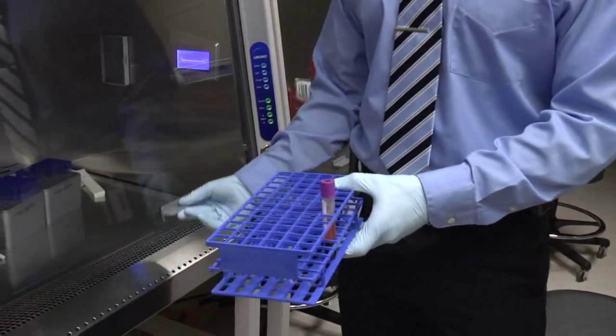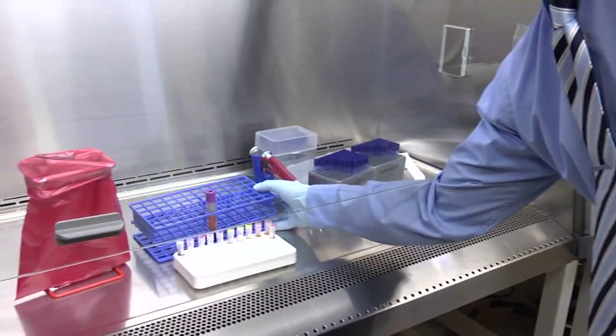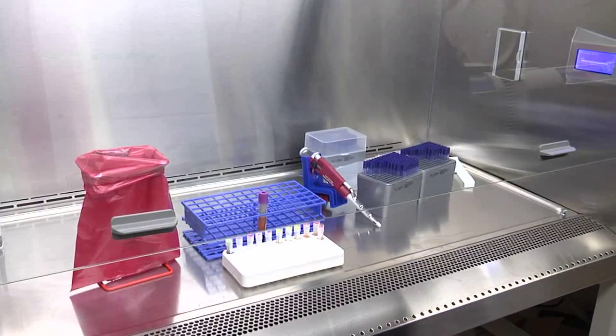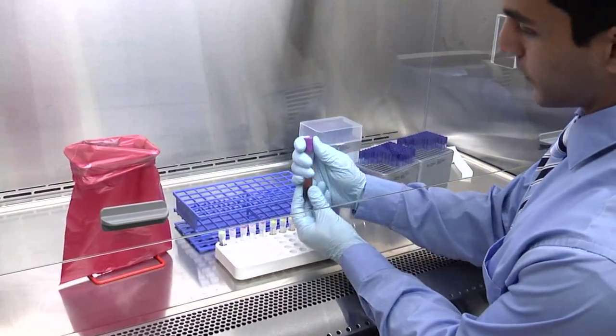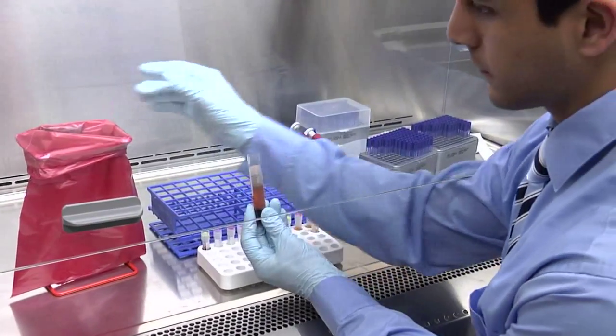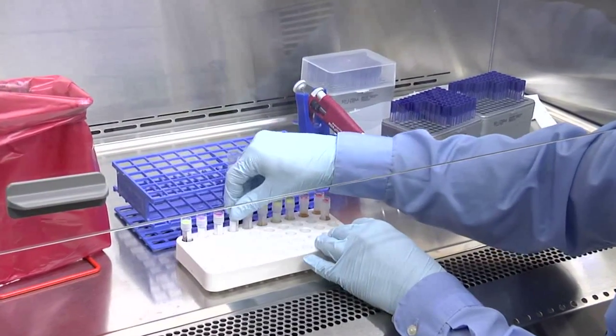After the sample is completing its processing, come over here to the hood and place the sample underneath the hood. Take out the blood tube, ease off the cap, place the tube back in the rack, and start removing the caps out of the vials.